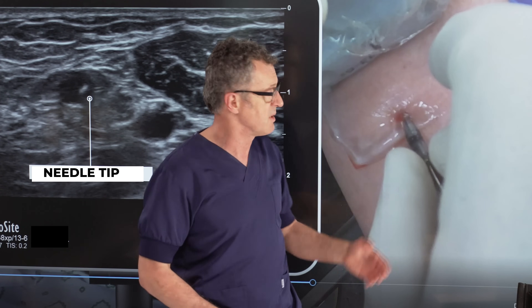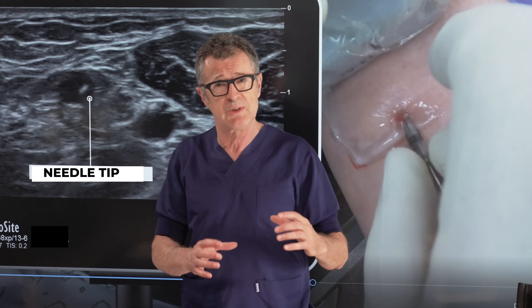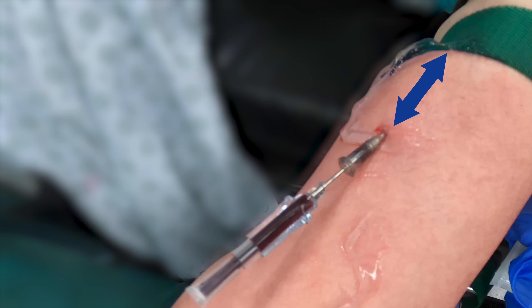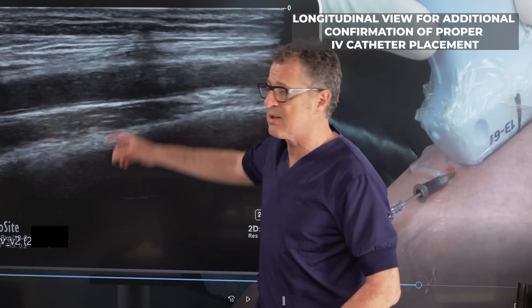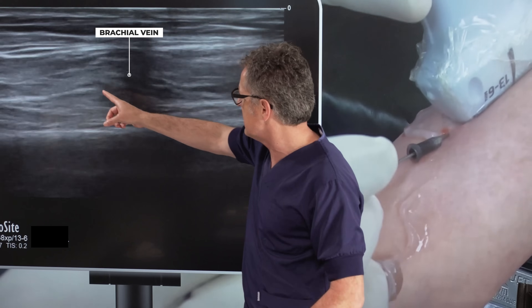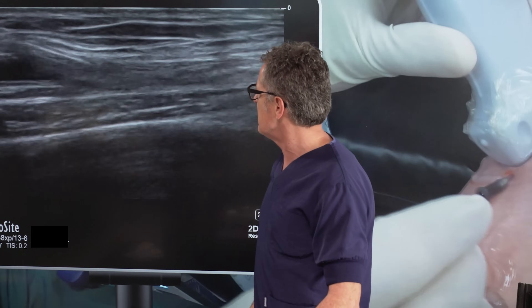We can quite clearly see that we are inside the vein and we have a flashback inside the needle-catheter system. At that point, you want to remove the needle, leaving the catheter inside. Remember, even though we used the out-of-plane technique, we continuously followed the path of the needle tip inside the brachial vein. Ideally, position the tourniquet a bit away from the site of needle insertion. Now taking a longitudinal view, we can see a very nice image of the brachial vein with the catheter sitting nicely inside it.